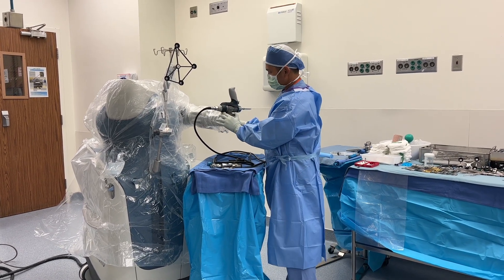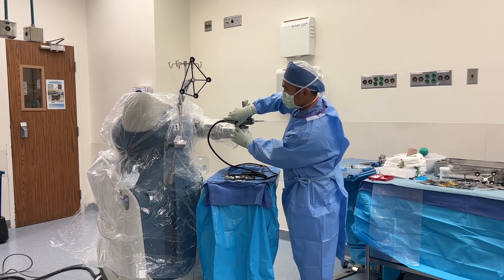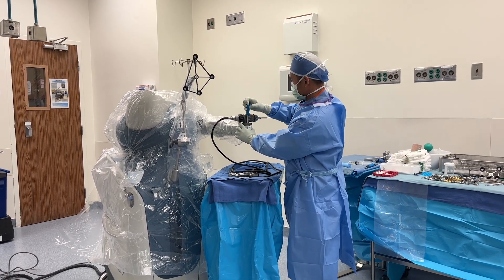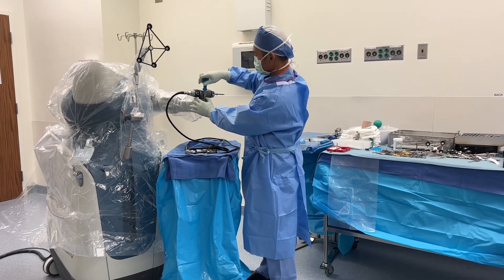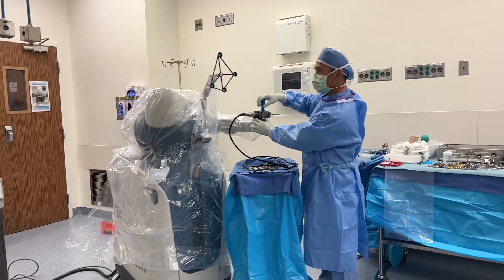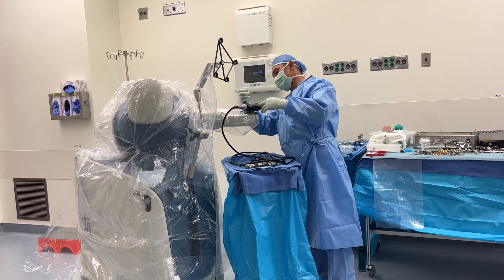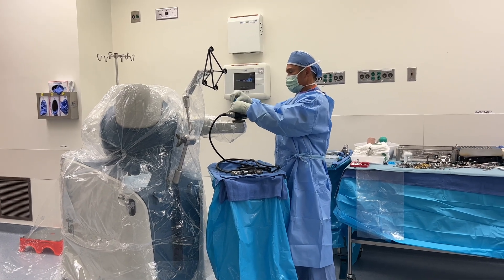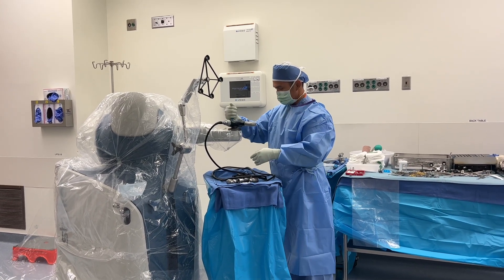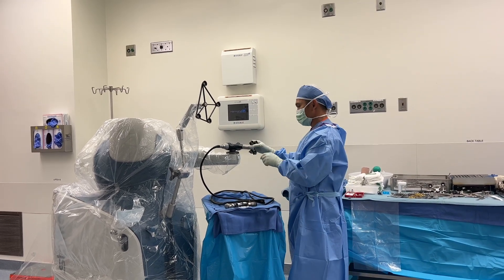Make sure you don't touch the inside part because that's not sterile. I'll have a screwdriver right here to tighten it up so it won't move.